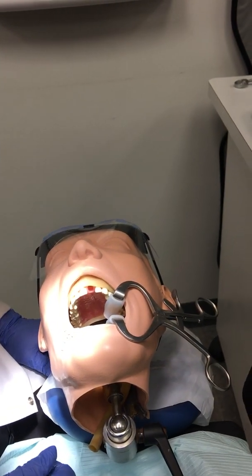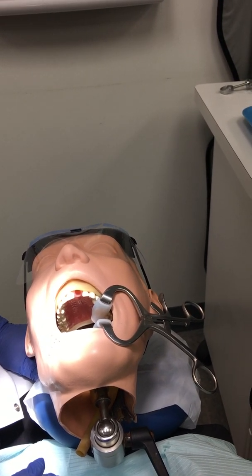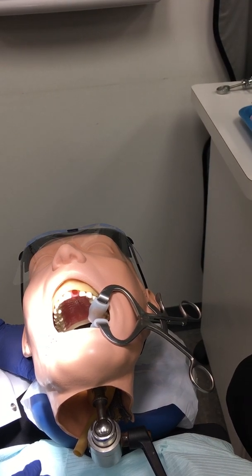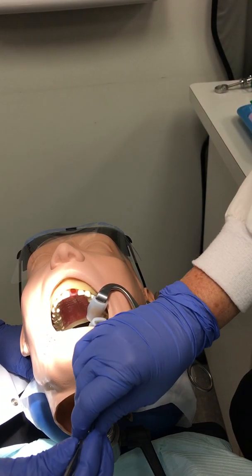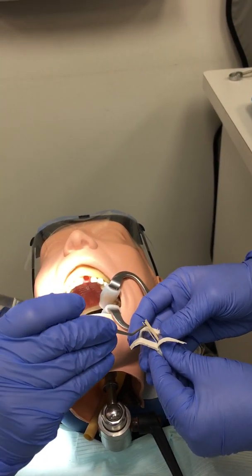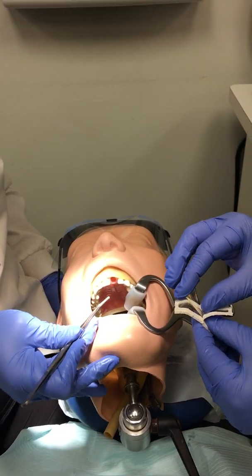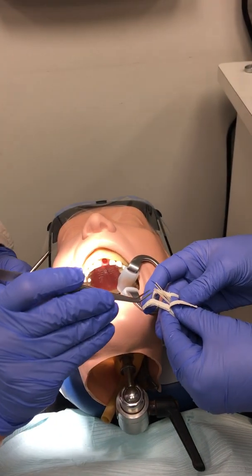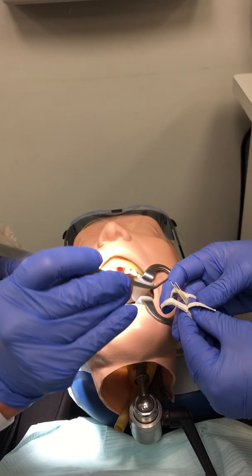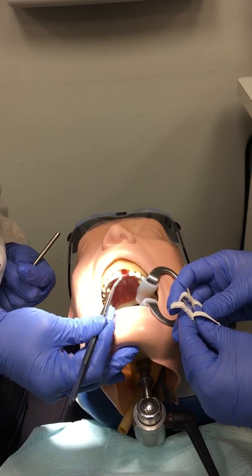Transfer a paper point in a locking cotton forcep to the doctor. Have about five paper points in the fan method next to the patient's chin, being sure to hold the pointy side of the paper point. The doctor will continue to use paper points until the canals are dry. If hemorrhaging does not stop, the doctor will place cotton pellets and a temporary filling, then reschedule the patient.